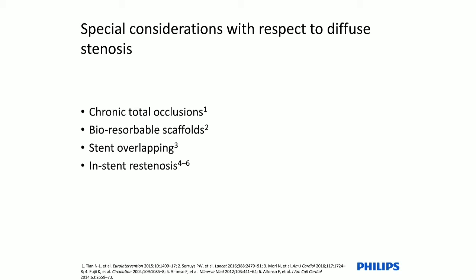It is also, of course, important in that situation because on some occasions you may disclose that part of this narrowing can be due to a different cause related to the procedure, for example, a vessel wall hematoma. That also may happen more frequently in the case of recanalization of chronic total occlusions.